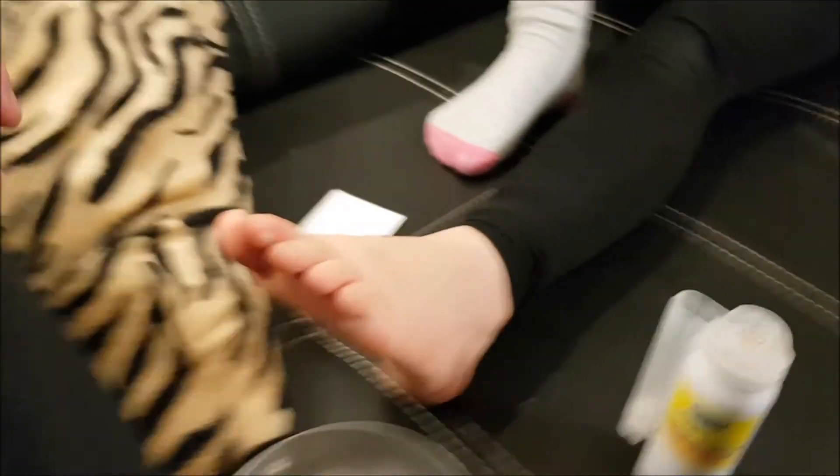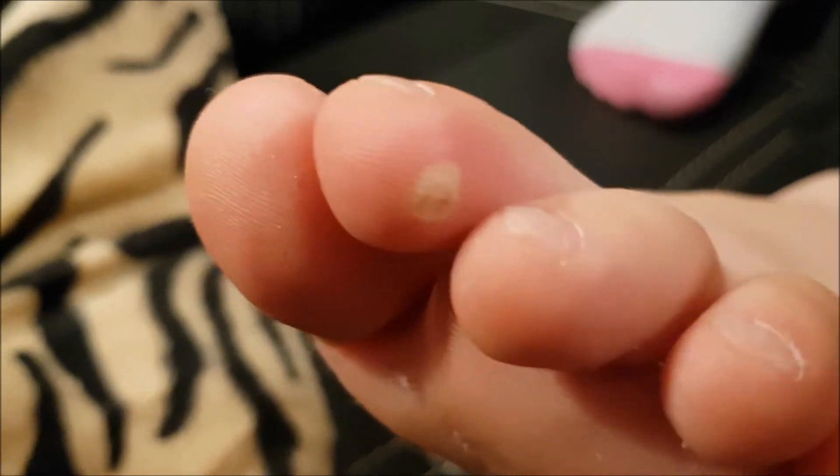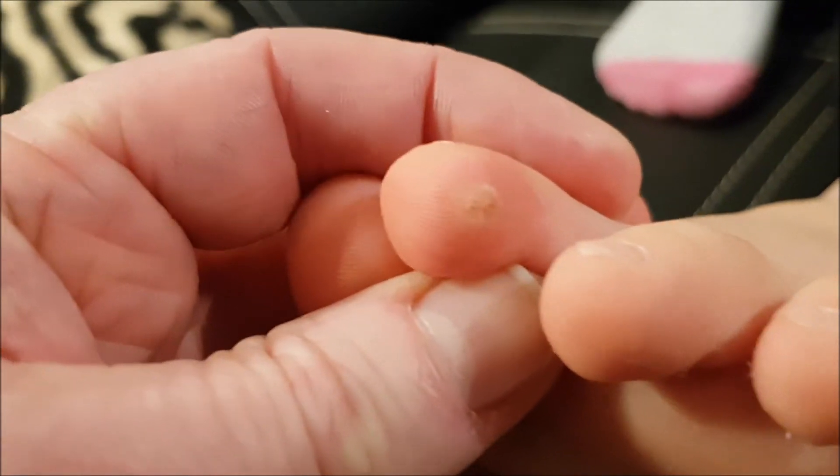Let me show you what happened. Now this wart has basically been frozen — it's like a kind of thermal injury, and you can see it here.